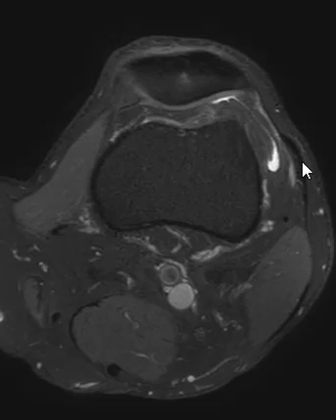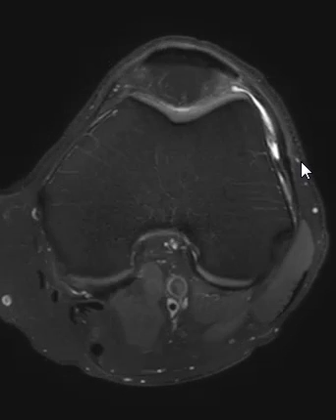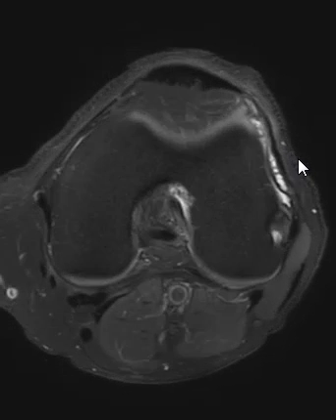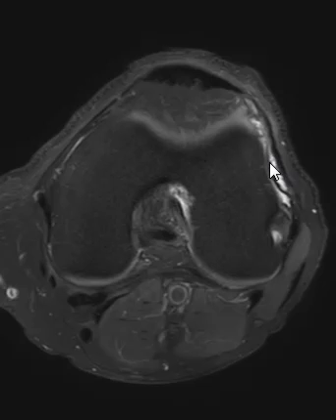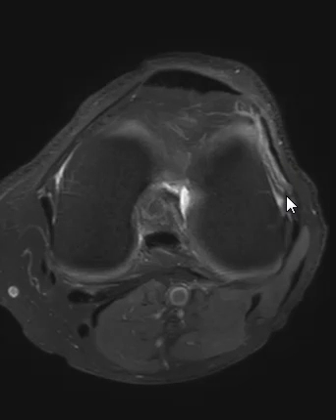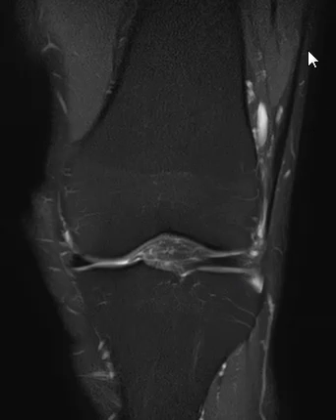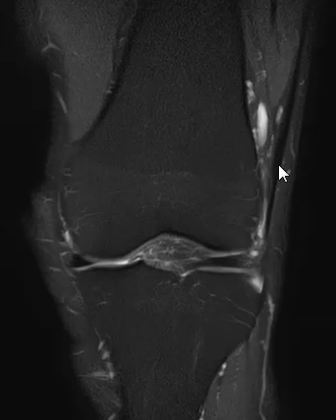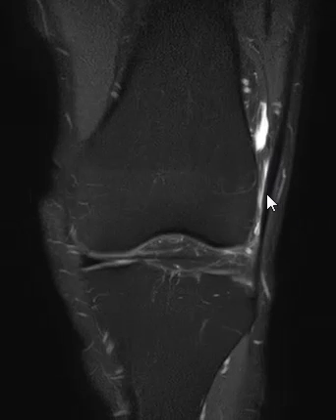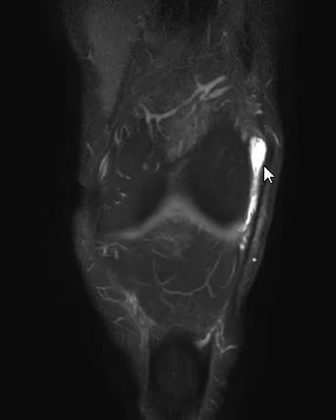And we go down here — this is above rather — as we go down, it goes all the way down to almost the joint line, you can see it right here. And we have another view of this; it shows up well on the coronal here, the iliotibial band coming down, and there we start to see the fluid, and there it is.